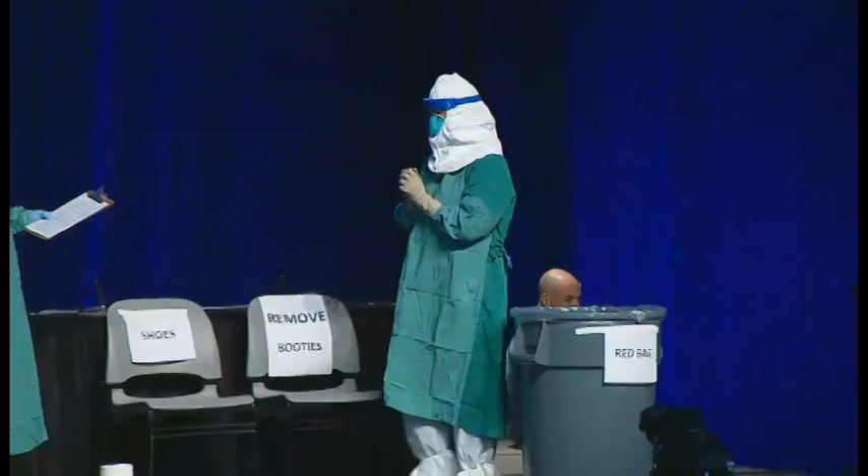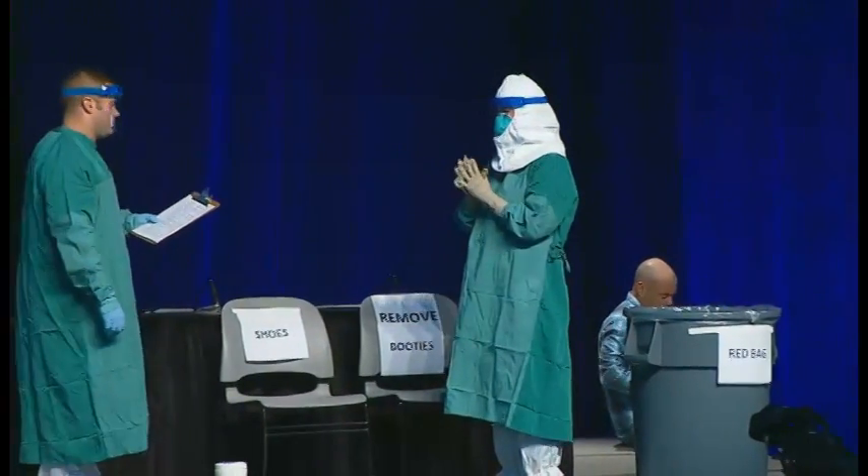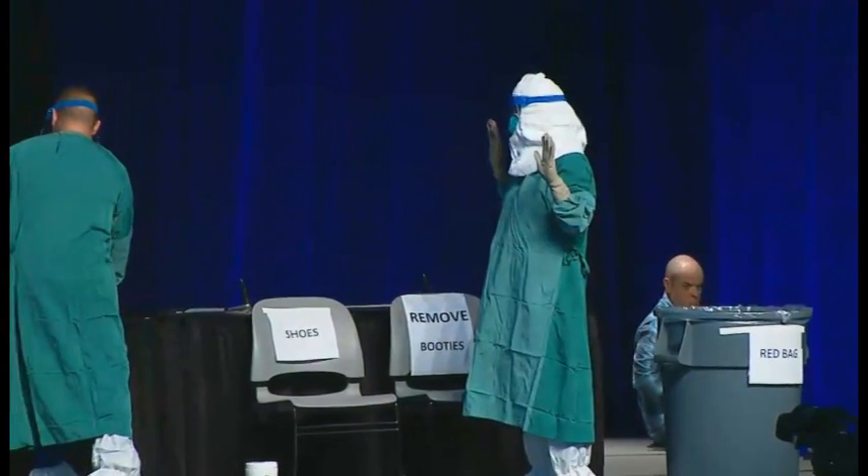When she is done, we need to remove the PPE and make sure she doesn't get exposed. The key here is she's not leaving the patient care room until she knows that the trained observer is ready and there to help her remove her PPE. She signals to make sure the trained observer is there, and she does not begin any of the removal of the equipment until the trained observer is ready to help.